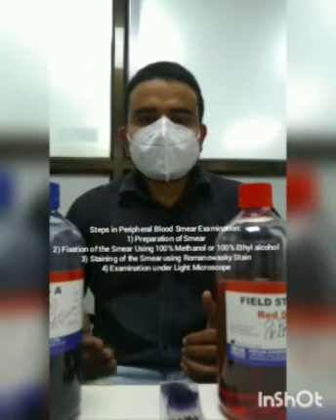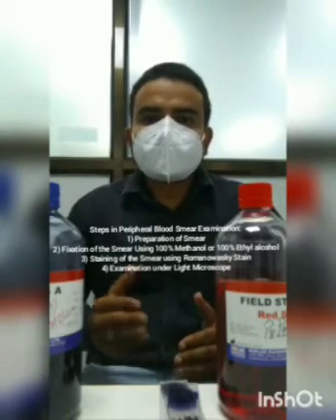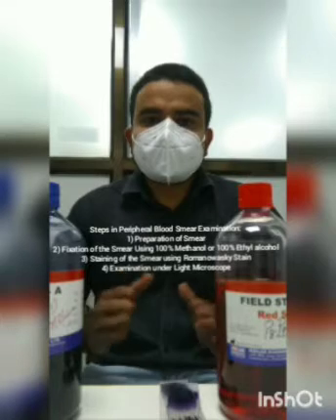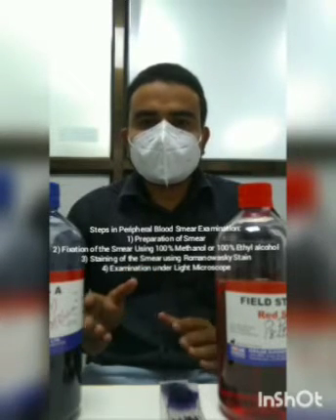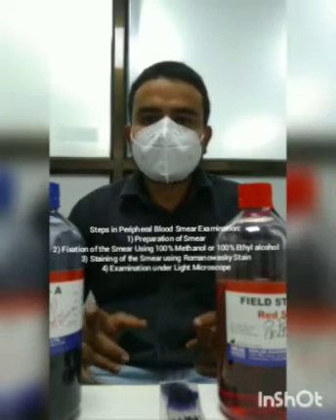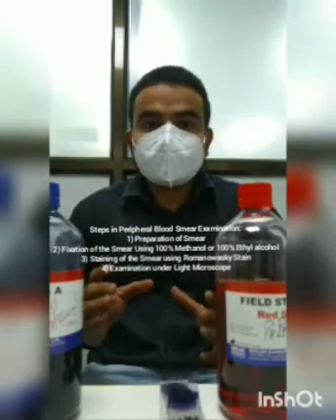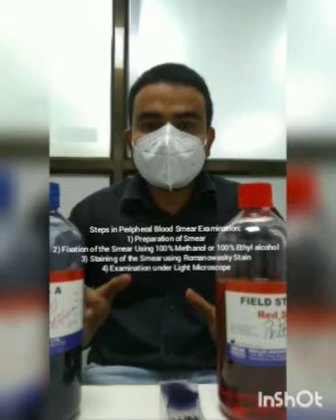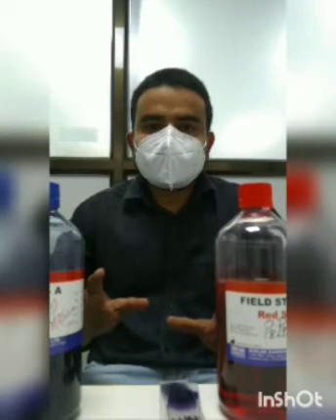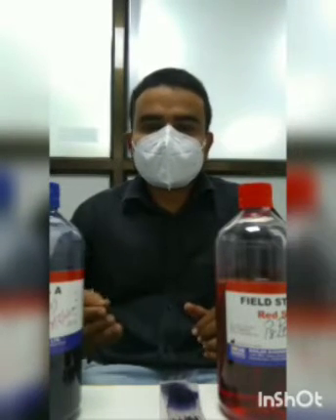After the preparation of the smear is done, there is fixation of the smear. Fixation is done using 100% methanol or 100% ethyl alcohol. Acetone-rich or water-mixed methanol or ethanol cannot be used. Only 100% ethanol and methanol can be used. After this fixation, we arrest the cells in their state and adhere them to the glass slide, and all their morphology is maintained. Later on, we stain it using different Romanovsky stains.